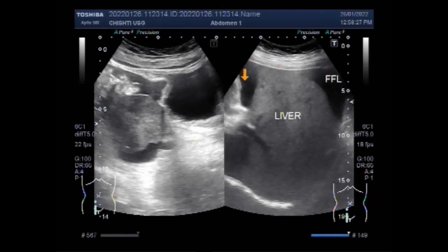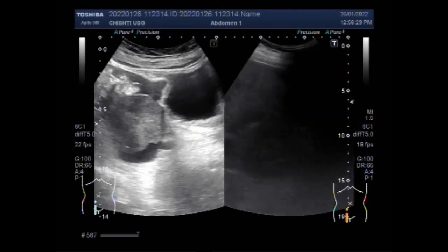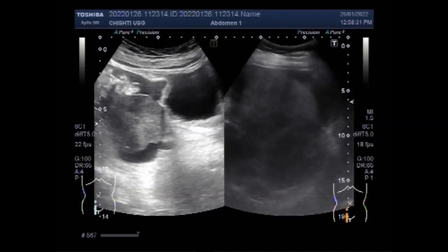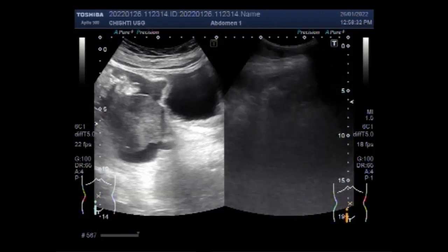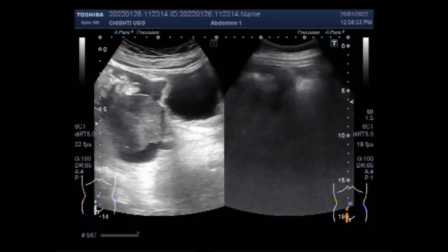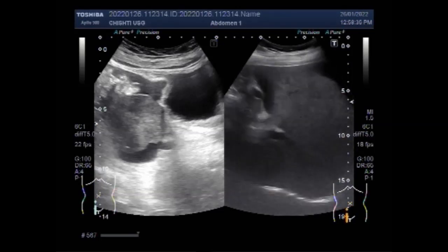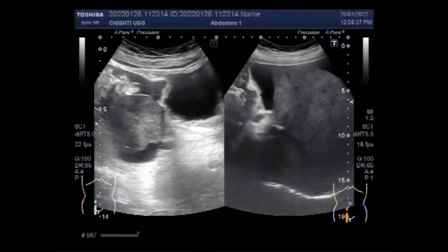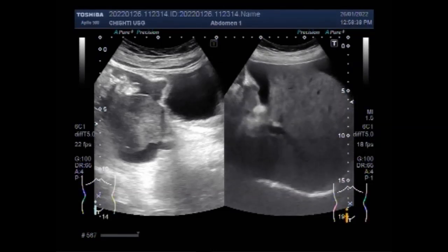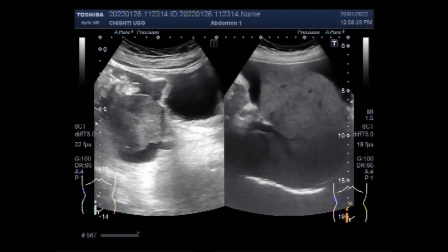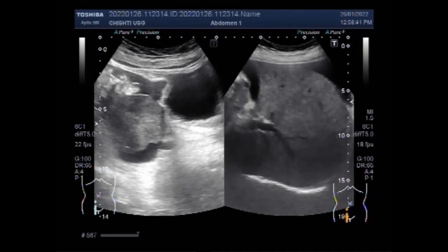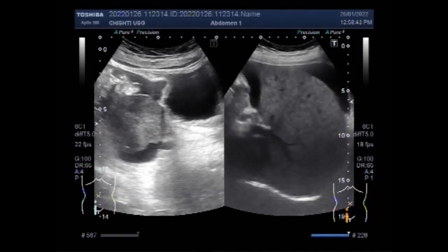This is the gallbladder. Again you can see the liver, and fluid is seen along the hilum of the liver as well as in Morrison's pouch.